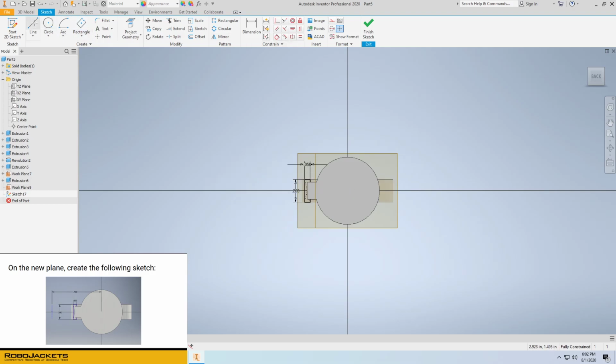Now we just need our construction line. The length doesn't matter, but what does matter is that it is 0.7 from the y-axis. I've made the y-axis visible. Now I'll project it so I can clearly get hold of it. I'll dimension out from here to my construction line, 0.7.